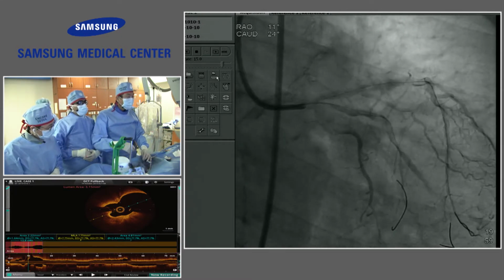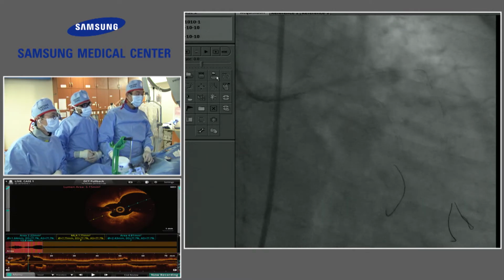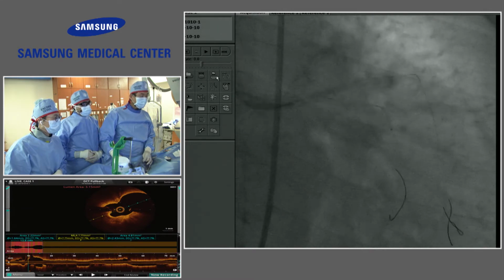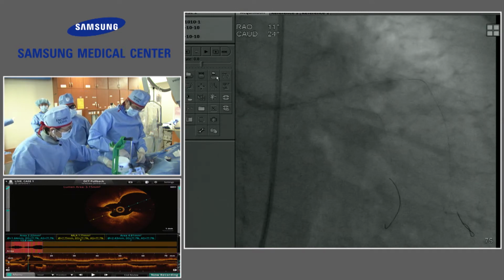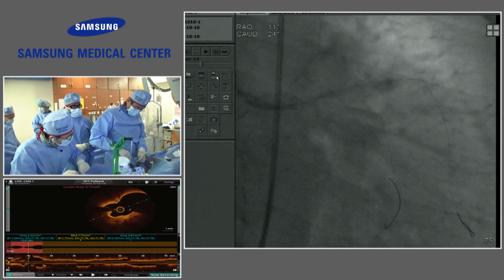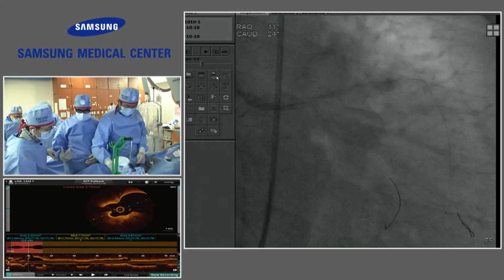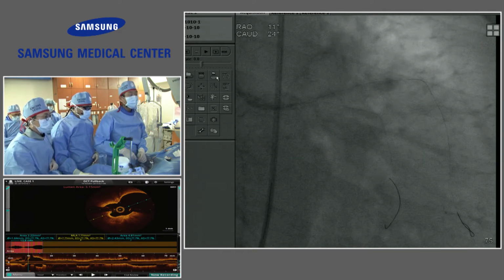One thing that we've noticed is we're not seeing a lot of branches down there. How about checking this with IVUS in this situation? That's an excellent suggestion. So which wire makes that kind of a horrible dissection? Run through. There was no resistance, I'm sure, but yes, wiring is very easy.